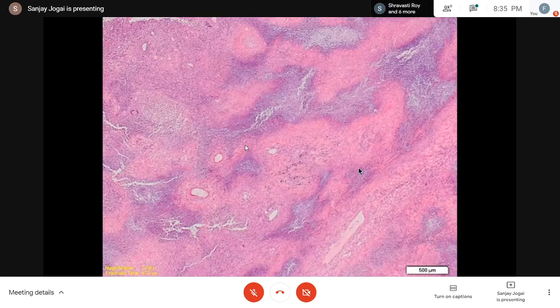And this is microscopy. So the absolute standard teaching, when you see on a scanner a section from the lung which shows this sort of geographic areas of necrosis, which is very blue, purplish blue, there's only one diagnosis that stands out, and often on a scanner, you can see these isolated giant cells. Professor Kevin Leslie from Mayo Clinic often says in his talks that the giant cells in Wegener's, or so-called Wegener's, now known as granulomatosis with polyangiitis, are very lonely. You don't see them very well formed as in granulomas. They are isolated, they are scattered throughout. So a very good clue to the diagnosis.